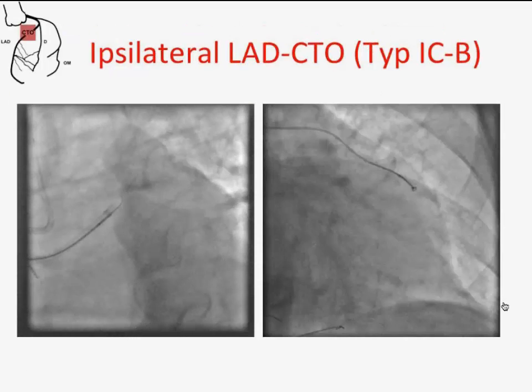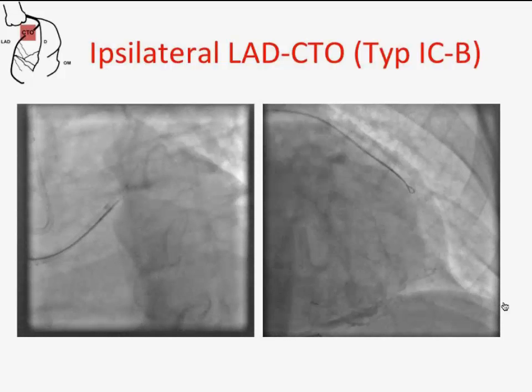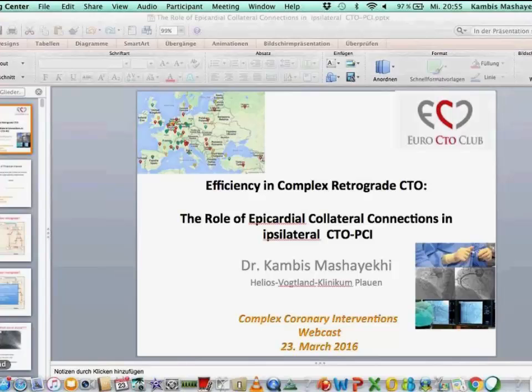Okay, here is a type B connection. It's a case which was tried in Lithuania.